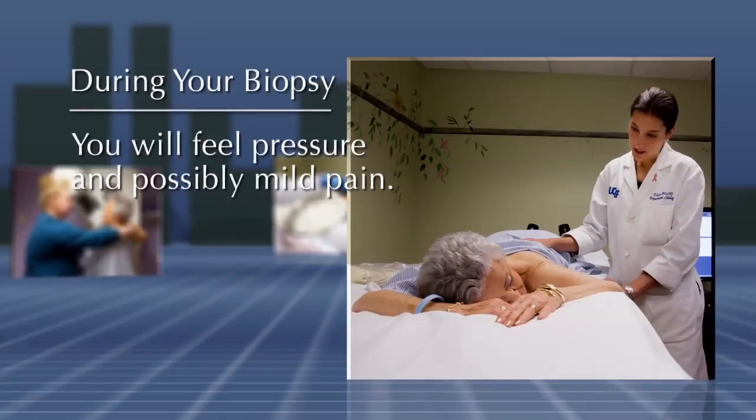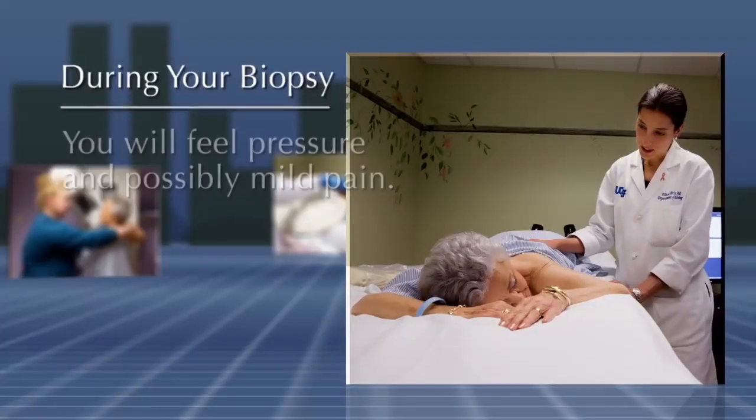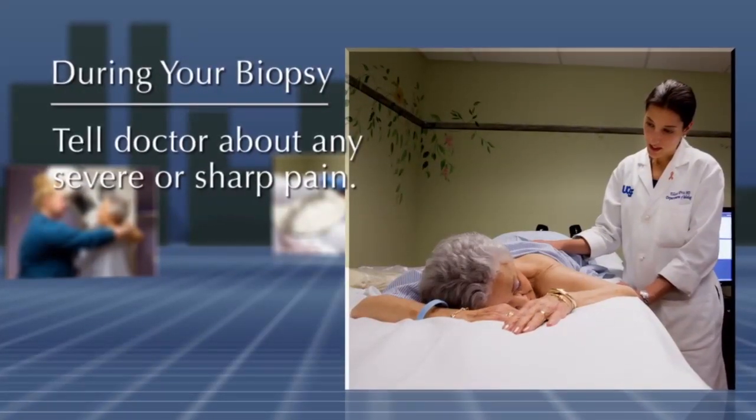You will feel pressure and possibly mild pain. If you feel severe or sharp pain at any time, let your doctor know.